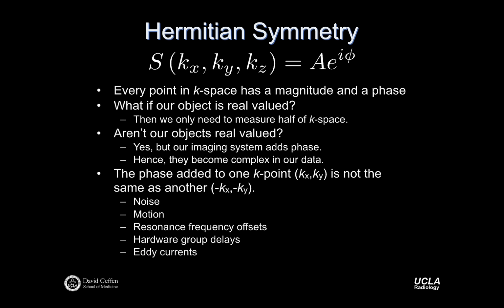And then something we haven't talked about too much, I think Mike will talk about this a little bit in the phase contrast lecture, but there are others. We saw one example of this in the lab, eddy currents, the aluminum board that was falling towards the scanner. Anytime we turn on the gradients, we can induce currents in conducting structures somewhere in the scanner. Conducting structures generate fields, those fields generate offsets, and those can cause problems. We refer to those as eddy current-induced fields.